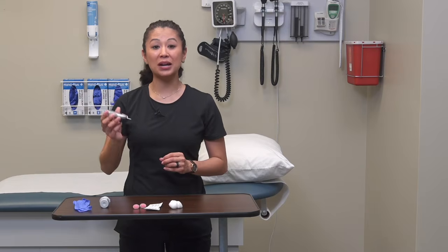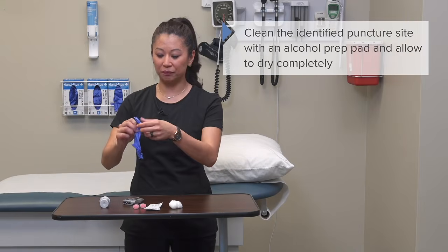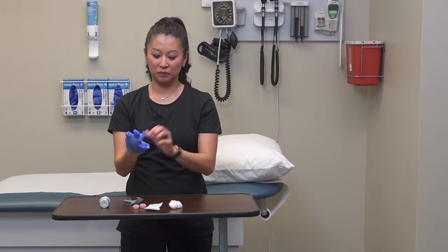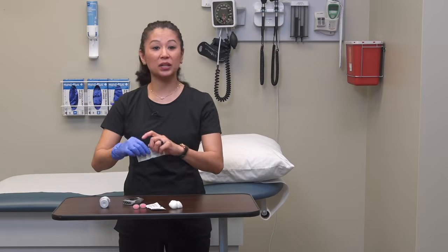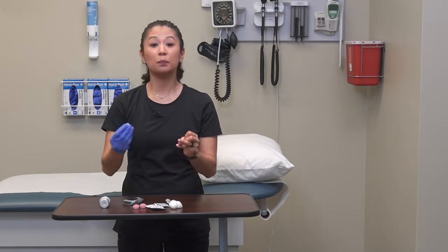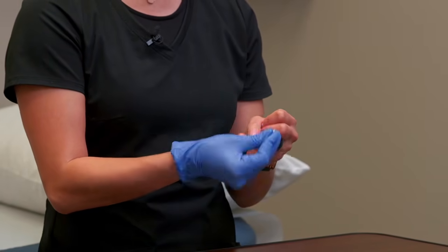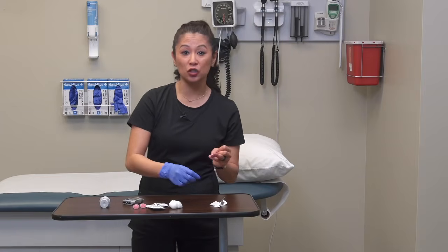So now that I've got my test strip ready, now I can go ahead and clean the site with an alcohol pad. Now, of course, I'm doing this all myself, but if I was in the hospital, I would be donning my gloves. So for this demonstration, I'm just going to do it on my own finger. So now I'm going to go ahead and take my alcohol pad, take the puncture site that I identified, and I'm going to make sure I clean this thoroughly. It's also important to allow this to completely air dry.